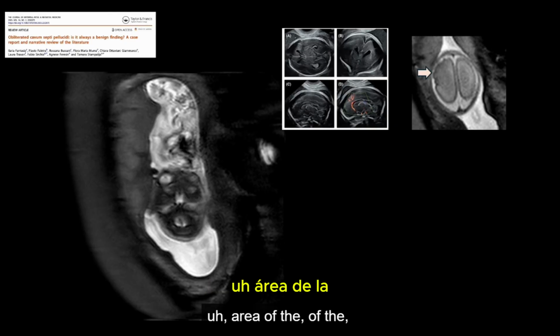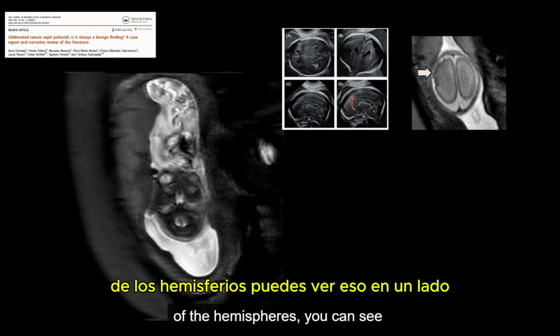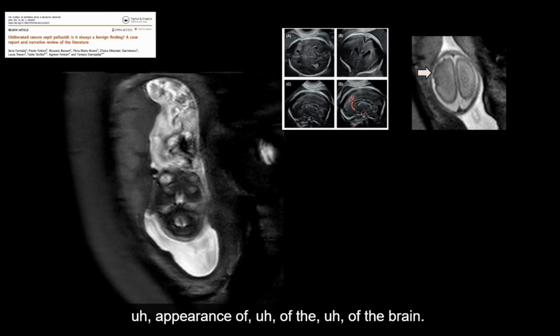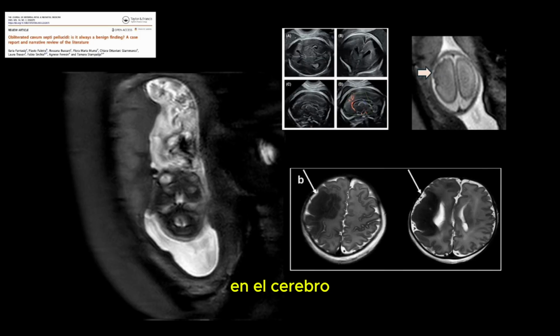but if you look carefully at the frontoparietal area of the hemispheres, you can see that on one side we have some irregular and hyperdense appearance of the brain.